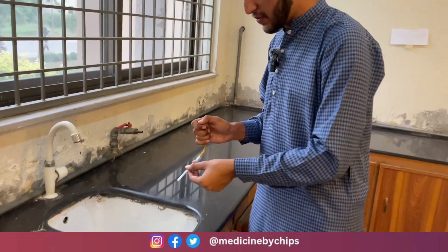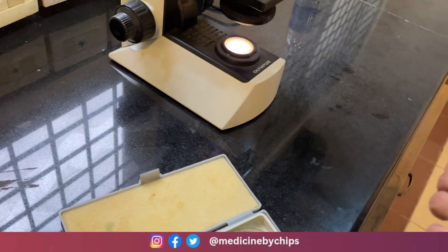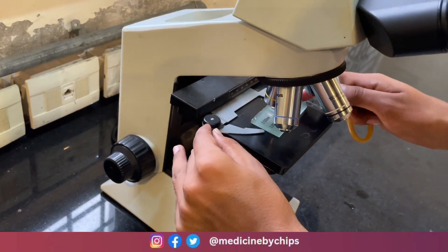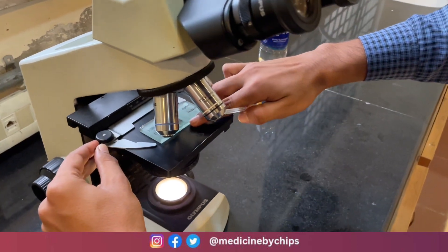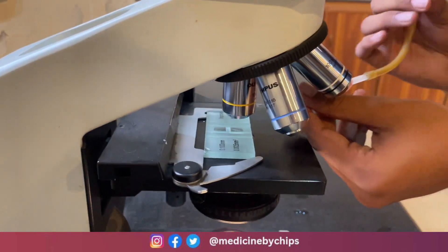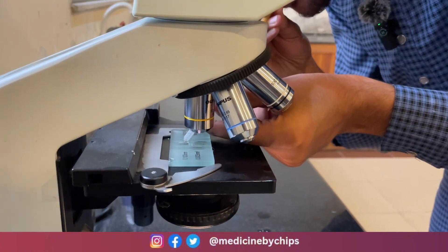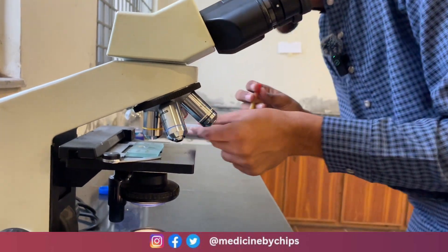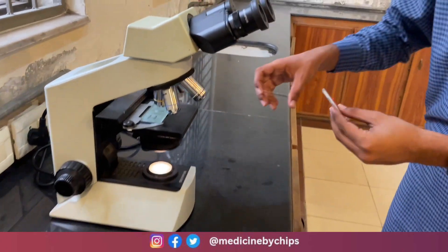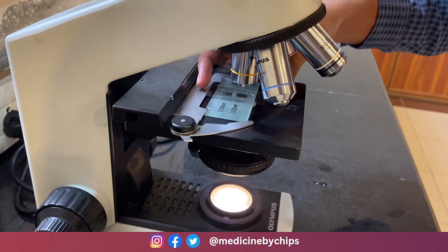Now we will charge the fluid onto the Neubauer chamber. We paste the Neubauer chamber under the microscope, charge it, and cover it with the coverslip. We place the coverslip very carefully.